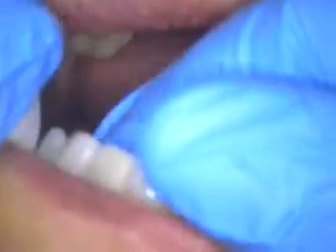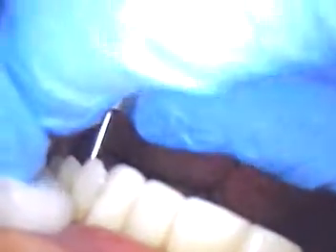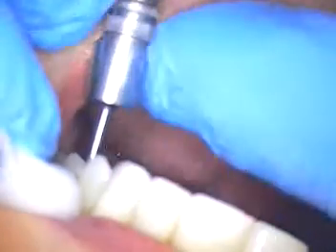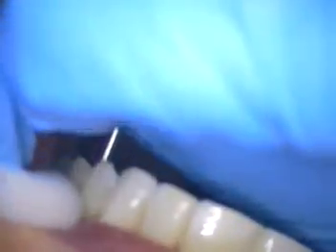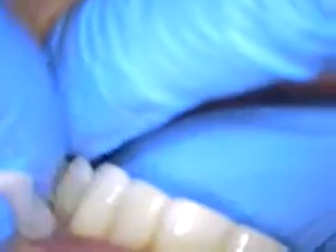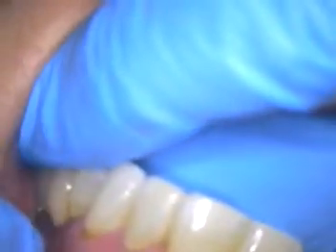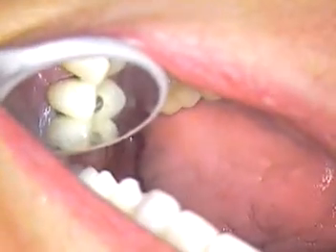Let me just see — we've got a little bit of cotton stuck here, and we'll find out if we need to undo the screw to get the cotton out. A little bit of cotton got pinched underneath, and let's just see if we can free that up — close a little. Okay, let's just make sure. We're good.